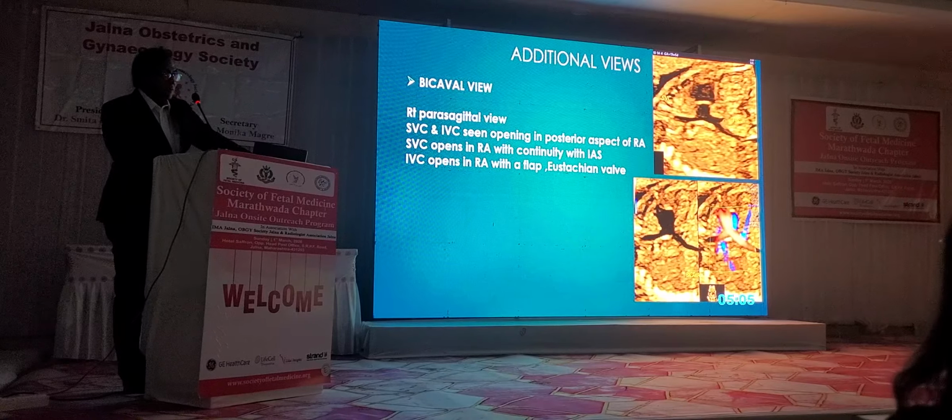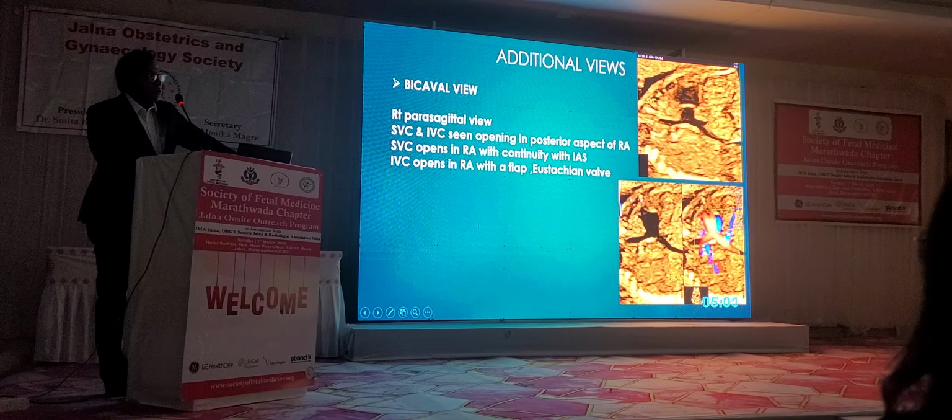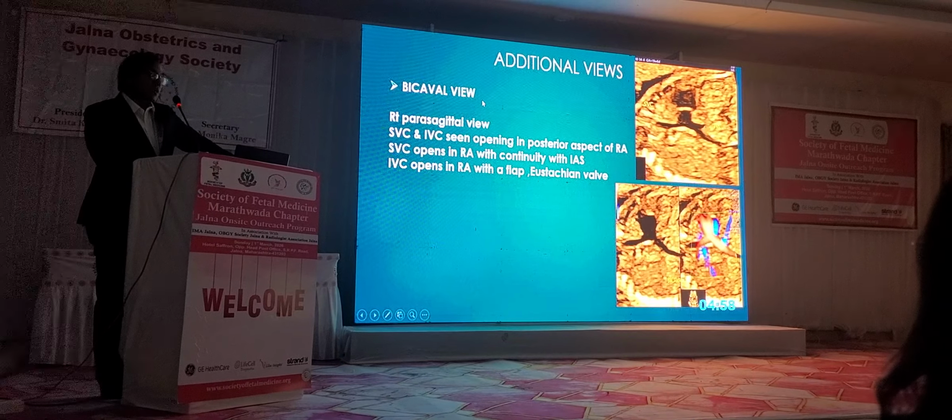So now additional views. Additional views are basically three, and all of those are sagittal views. So we'll start from the right. The most right one is the right parasagittal view. There is the bicaval view, also called the hammock view.